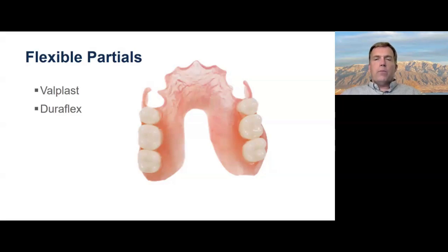Duraflex is a newer polypropylene-based material. It's a little less translucent. The coloring is slightly different, but the main advantage to it is that you can repair it. So that's helpful.